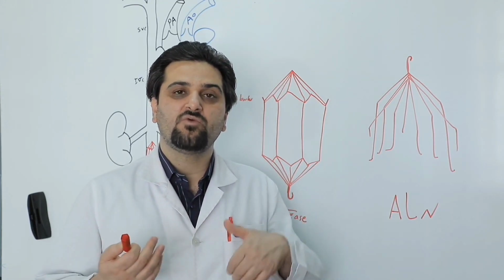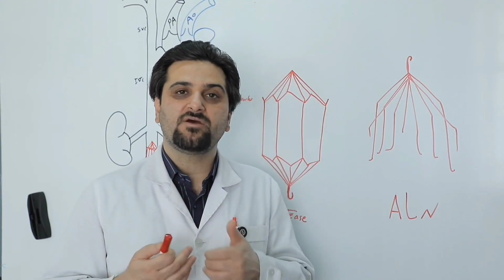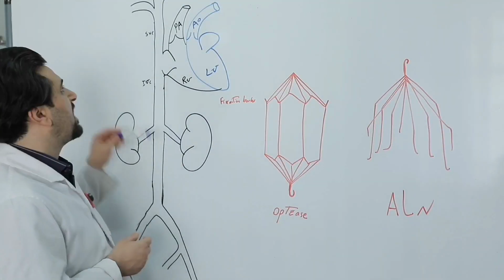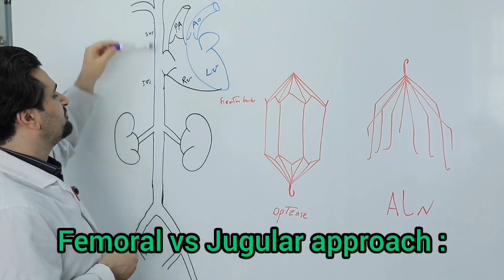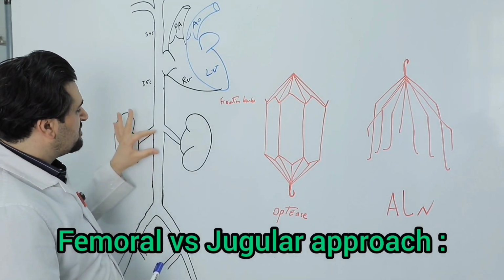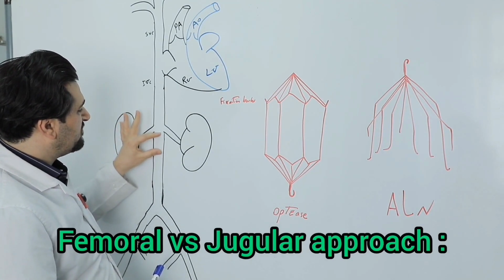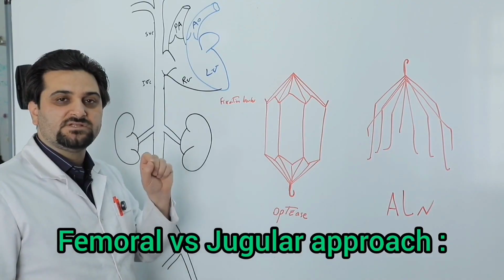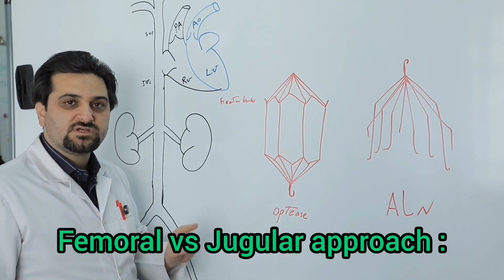And this time, with a new embolism that occurs, the patient might not survive. The IVC filter can be placed through two routes, either via the internal jugular vein or via the femoral vein. The important thing is that in both cases, the site of IVC filter placement should be below the renal vein. Which route is used to place the IVC filter depends on the operator's experience.